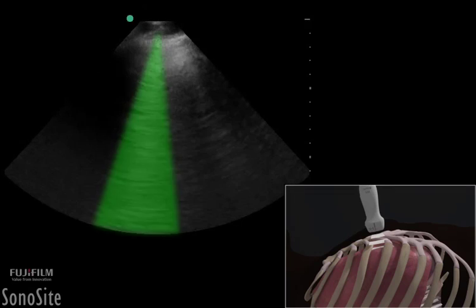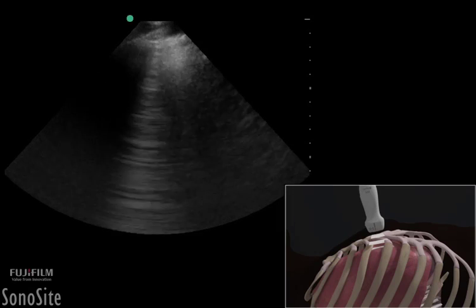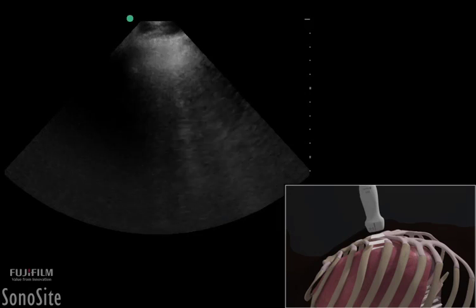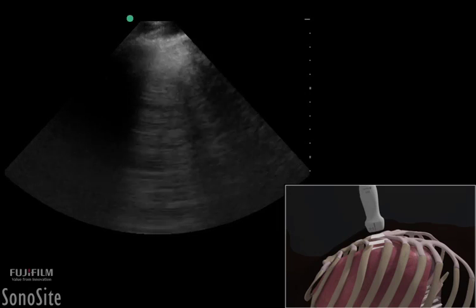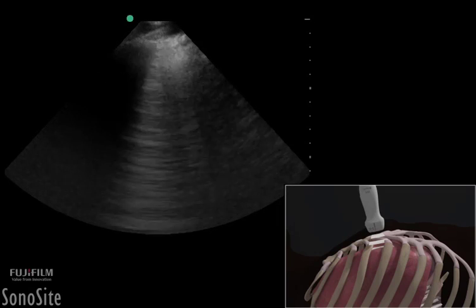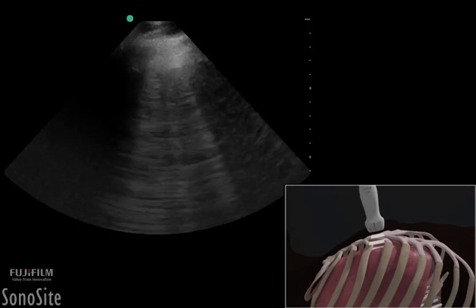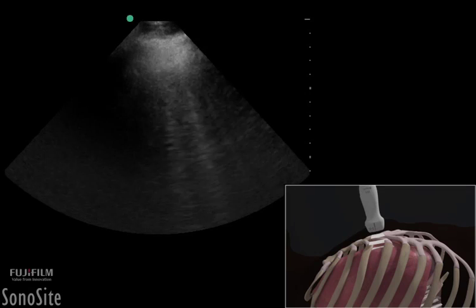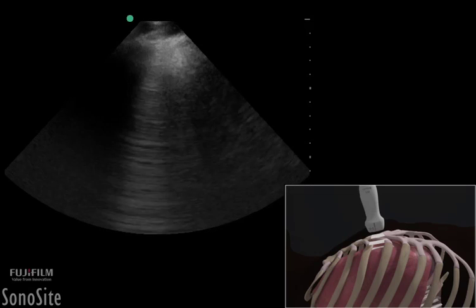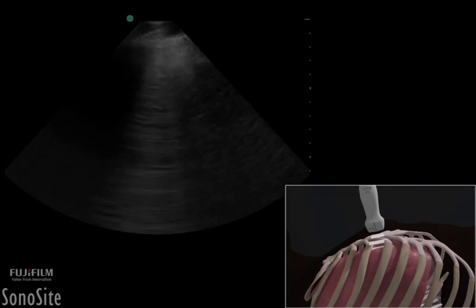These vertical lines are termed B-lines and have been shown to linearly correlate to the severity in lung parenchyma aeration. The greater the number of B-lines depicts the greater areas of difference in tissue density in the lung parenchyma captured in the ultrasound plane. Thus, the process to evaluate the entirety of the lung involves placement of the ultrasound transducer in several places along the thorax. Summation of the number of B-lines in each quadrant, along with the total number of B-lines, have been demonstrated to be effective strategies at quantifying the magnitude of lung airspace disease.